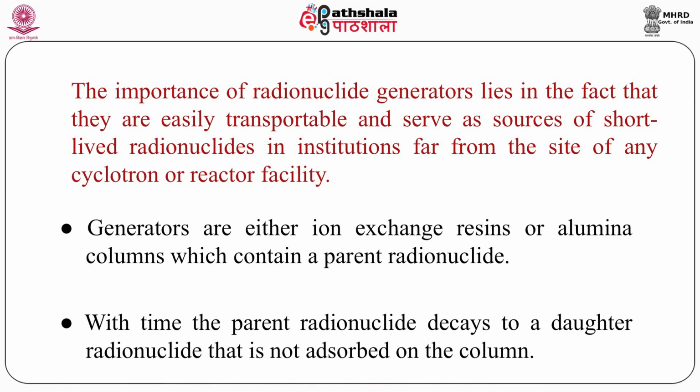The parent is molybdenum in this case, and it decays to give technetium, and finally our job is to elute technetium from there.